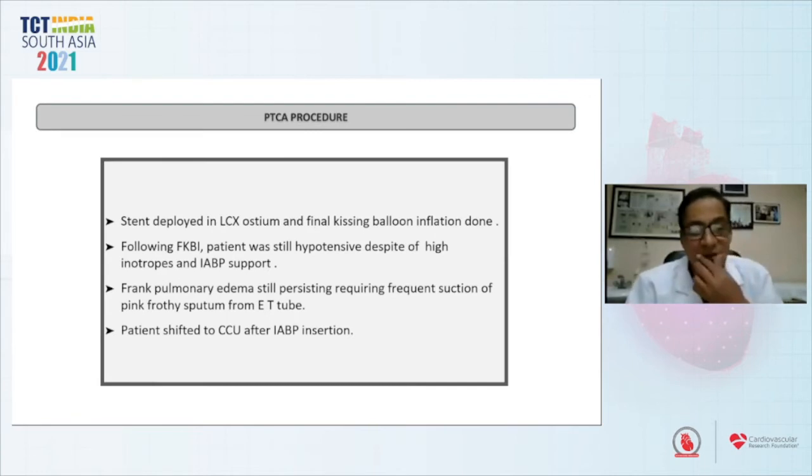And still, within that time, intermittent CPR was also being done, and at least thrice he required intracoronary adrenaline. So that's how it helps you, and it bailed me out by making things too smooth for me.